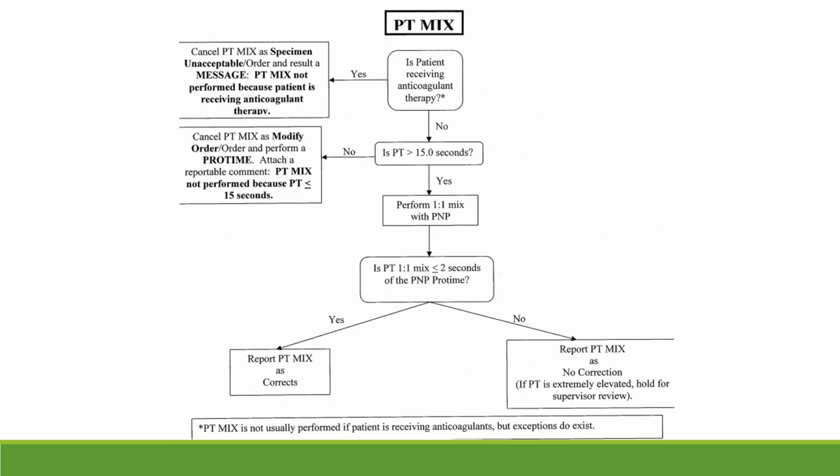All right, so our PT mixing study, again, this is also a clot-based test. If the patient is receiving anticoagulant therapy, we do cancel it most of the time, but although it's usually not performed on patients receiving anticoagulation, there are some exceptions that do exist. So if the physician insists that we do it, or if they're on a different type of anticoagulant that wouldn't affect the PT, we may do a mixing study for those patients at the doctor's request.